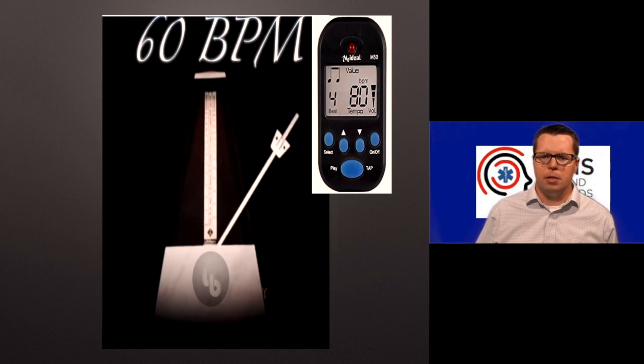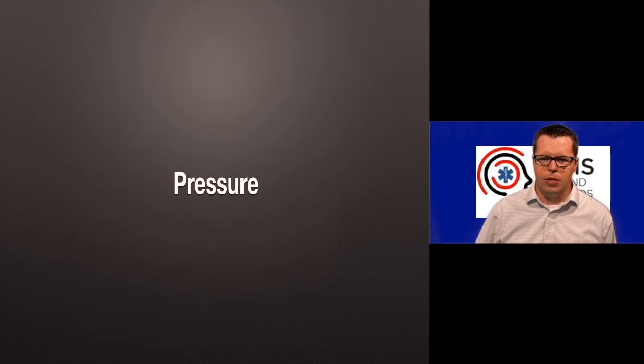You can do a lot with this, but something that gives you consistent timing and an audio cue is super important, because none of us know realistically what 4 seconds feels like when you're actually dealing with a patient. So get your metronome and use that.